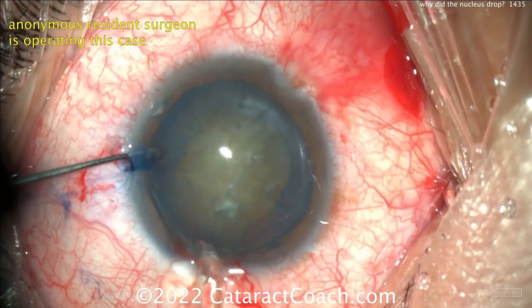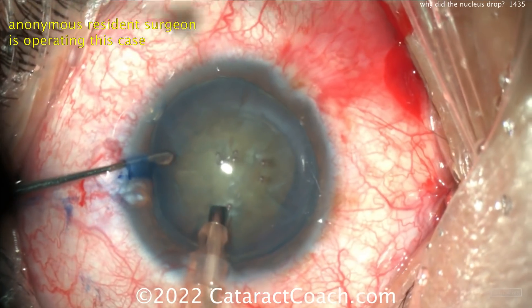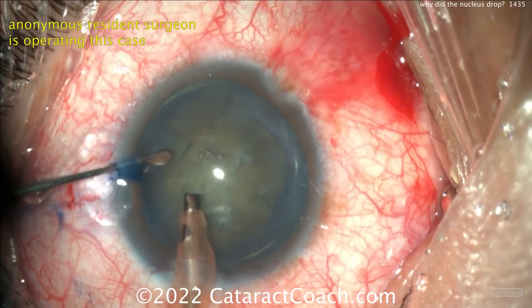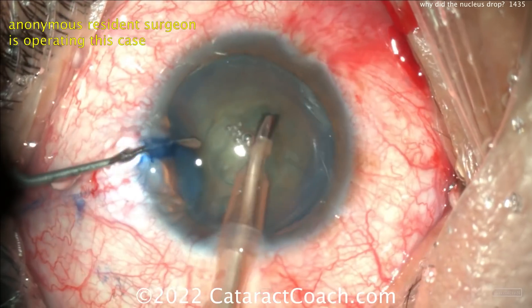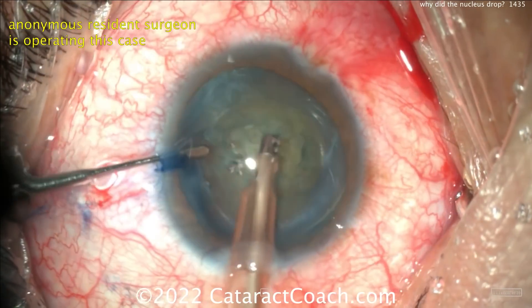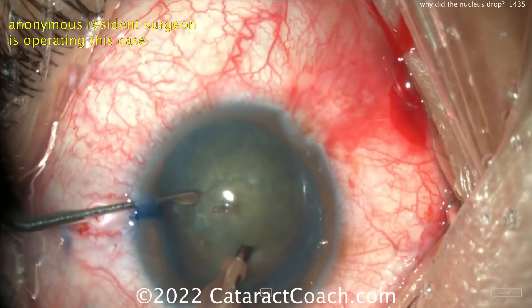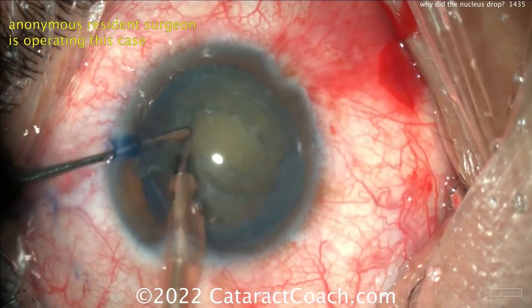A little bit of hydrodissection — it looks like also a little bit of a golden ring of delineation. Here comes the phaco probe going inside the eye. Now cleaning up the anterior cortex, but look how the whole lens is moving around. The rhexis shouldn't be moving so much. The rhexis is moving — it means you have weak zonular support or issues with that.